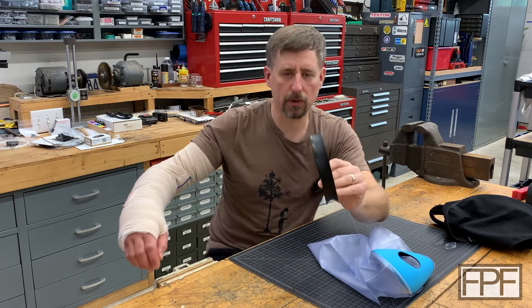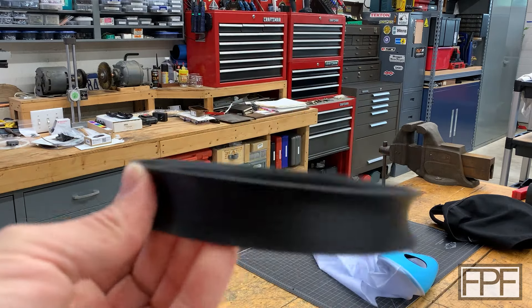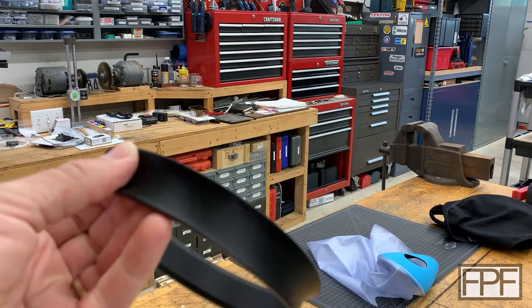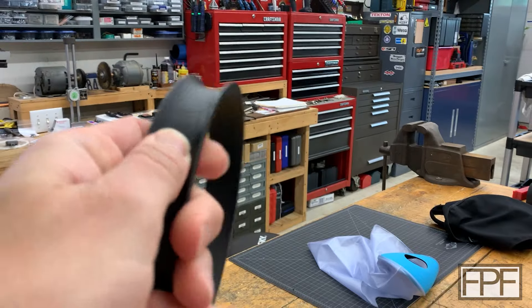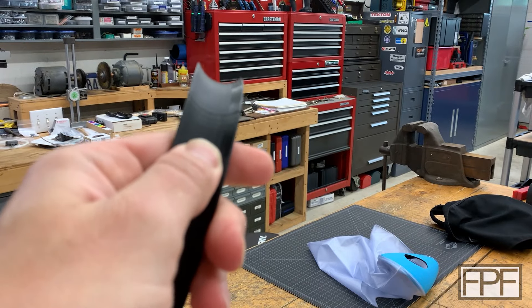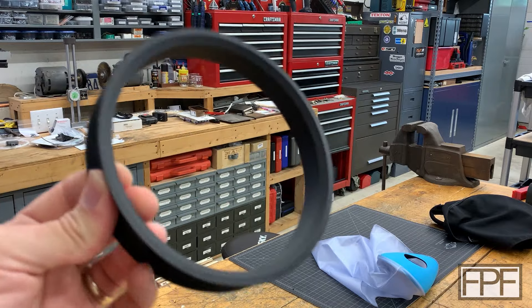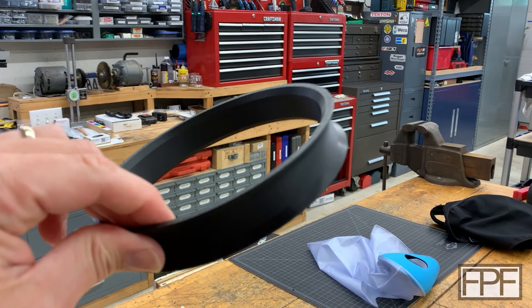I'll put it up closer to the camera so you guys can see the overall shape of this. And I will, of course, make the STL for this available just like everything here on the channel. It basically just has sort of a gutter in the center to retain it so it doesn't slip out, and I've rounded over all of the corners so that it slips easily on my arm as well.